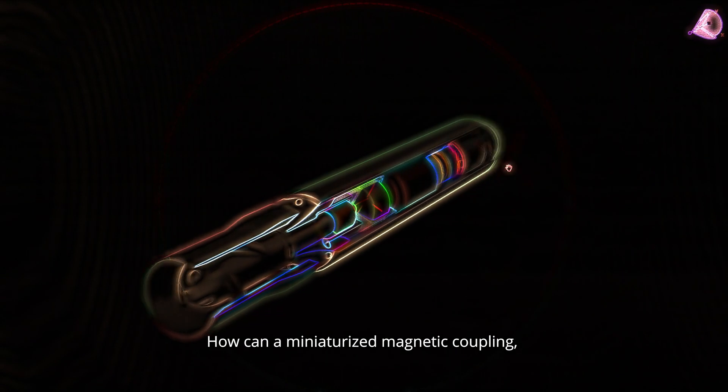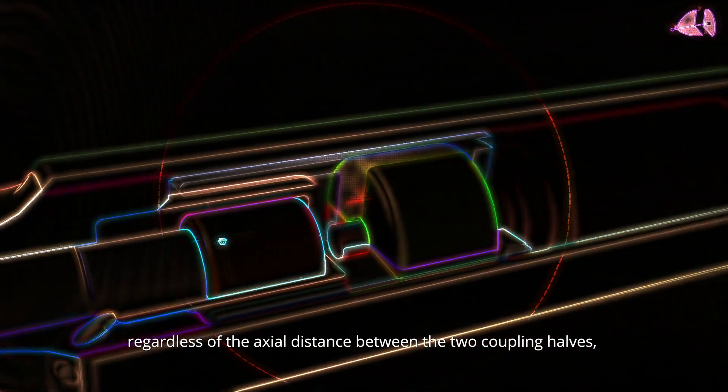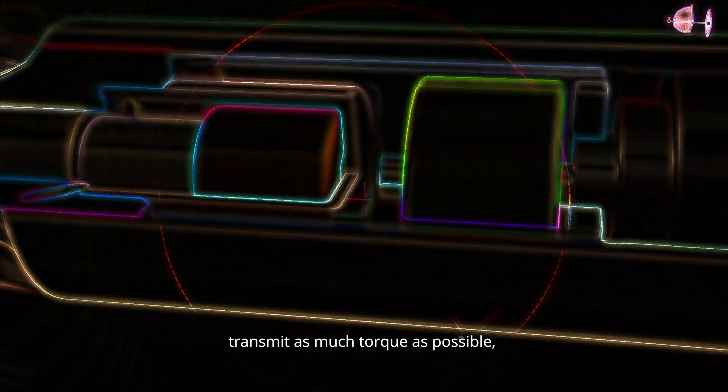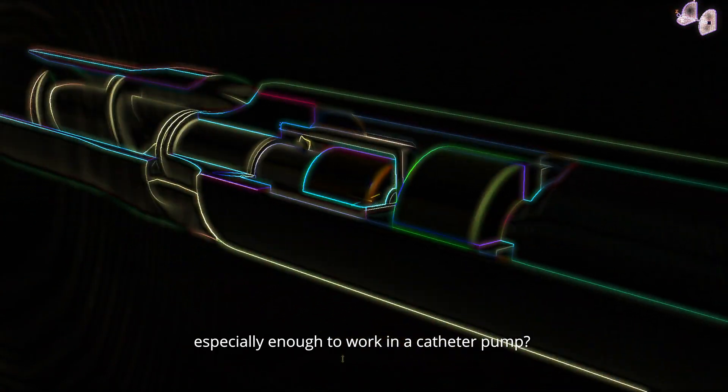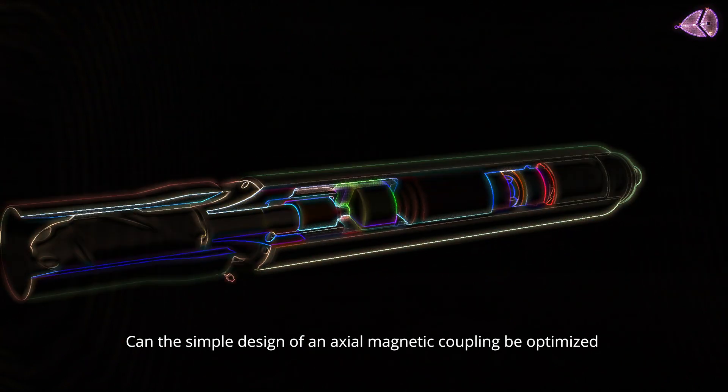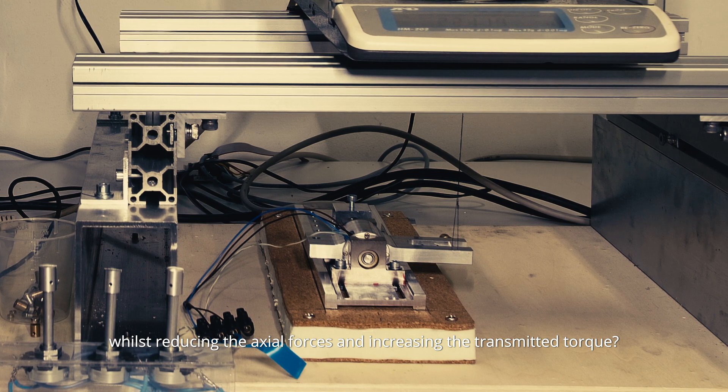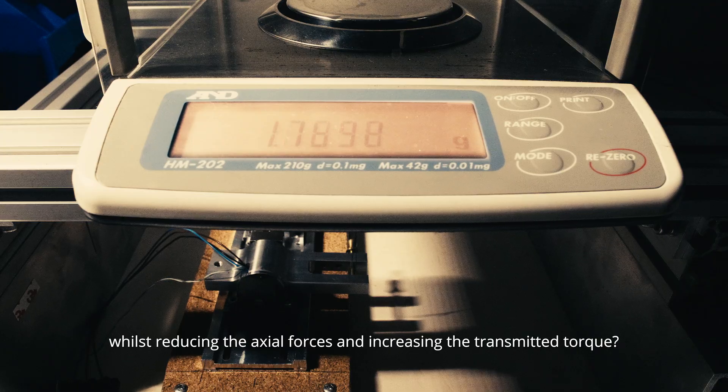How can a miniaturized magnetic coupling, regardless of the axial distance between the two coupling halves, transmit as much torque as possible, especially enough to work in a catheter pump? Can the simple design of an axial magnetic coupling be optimized whilst reducing the axial forces and increasing the transmitted torque?